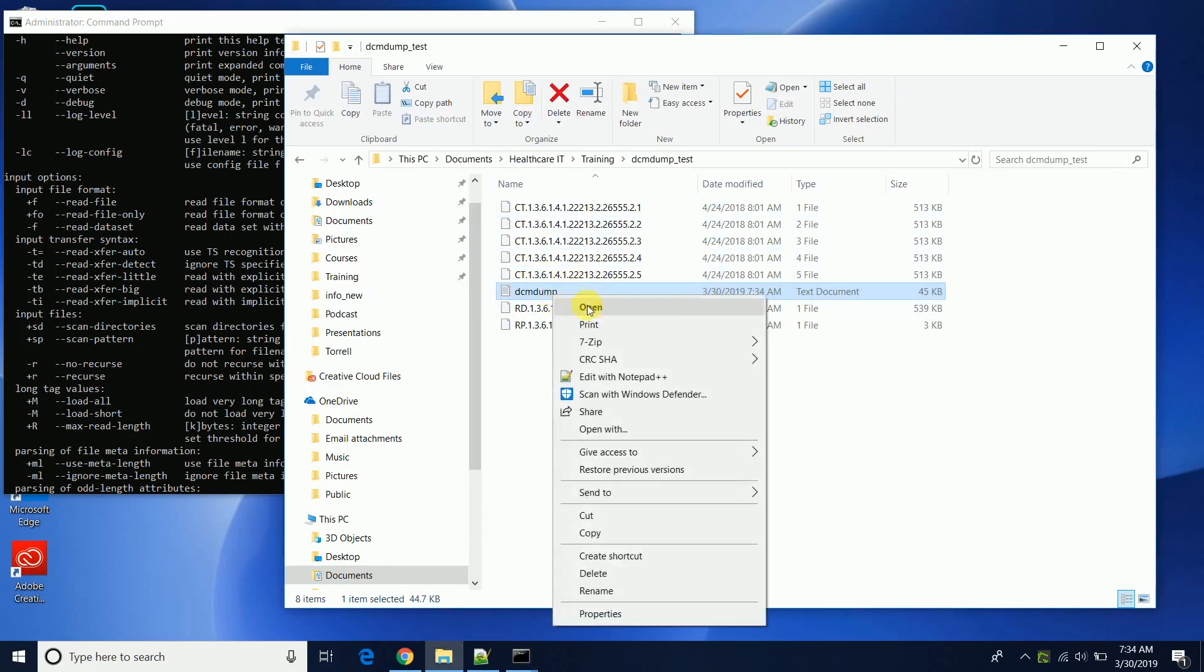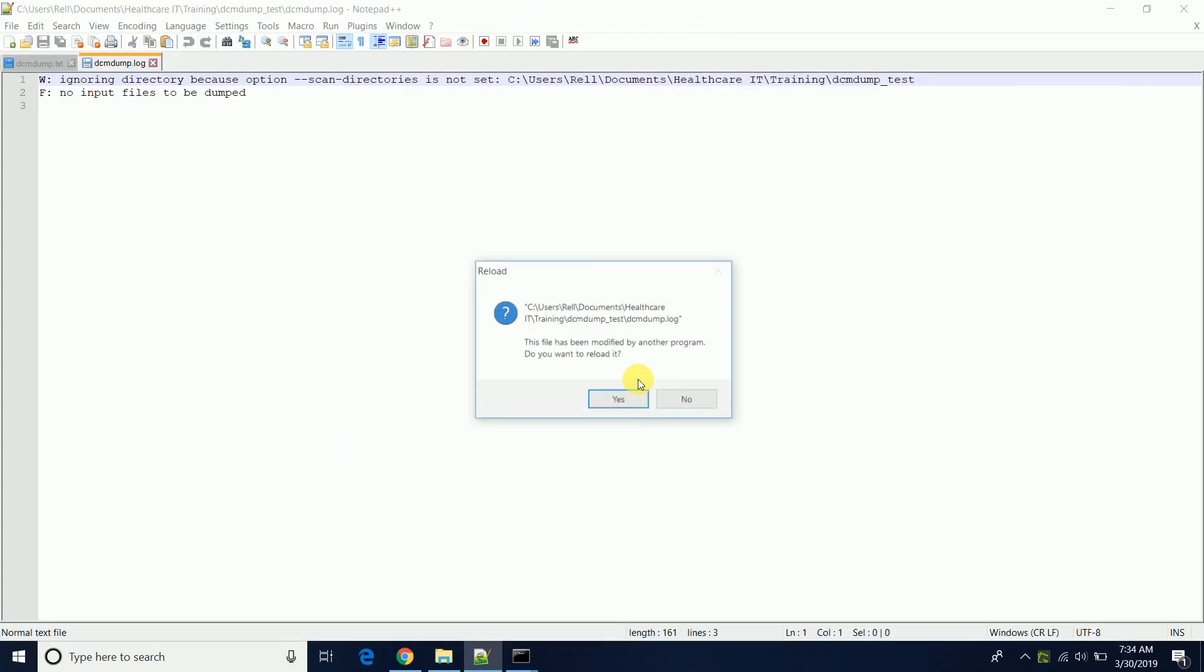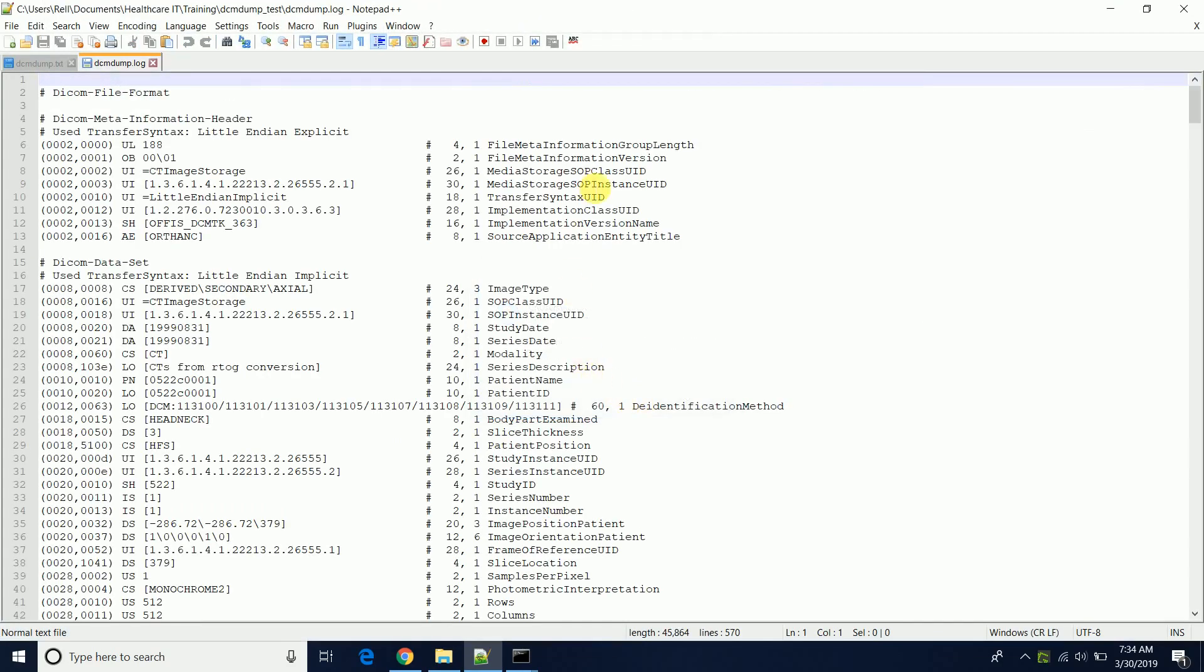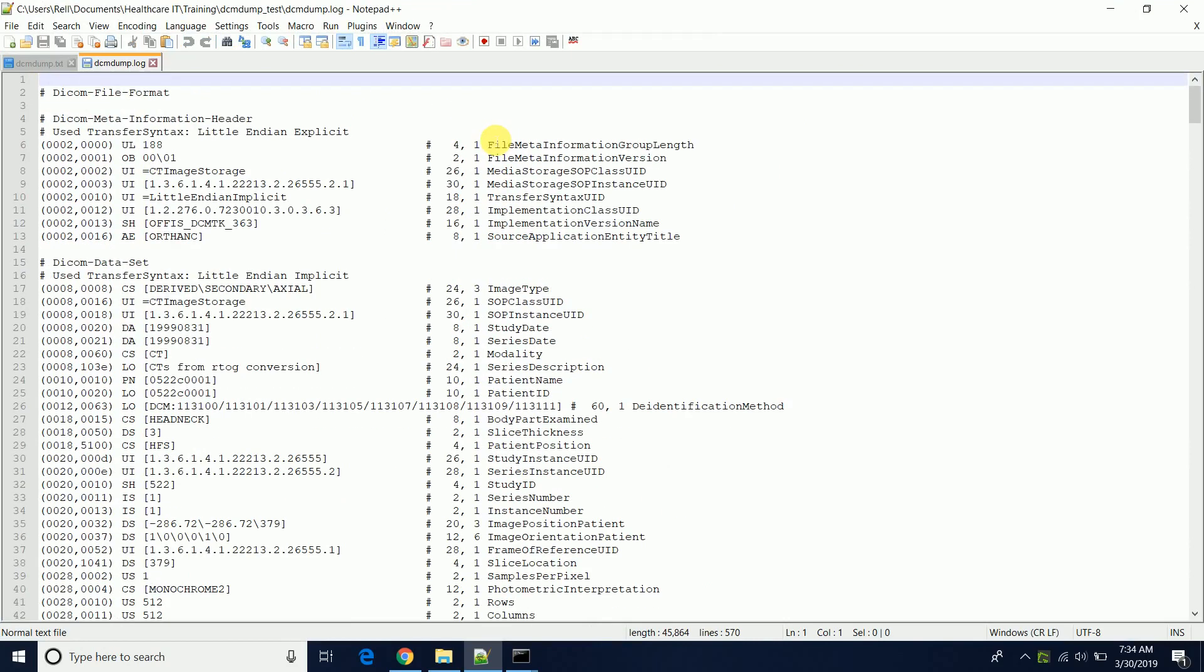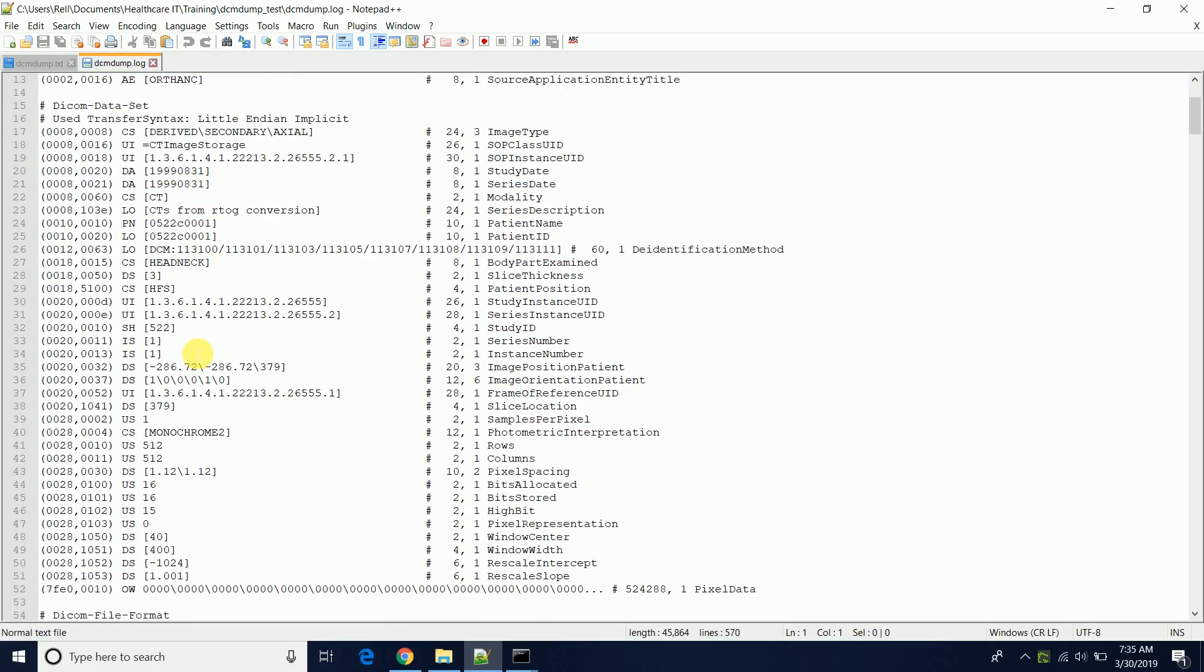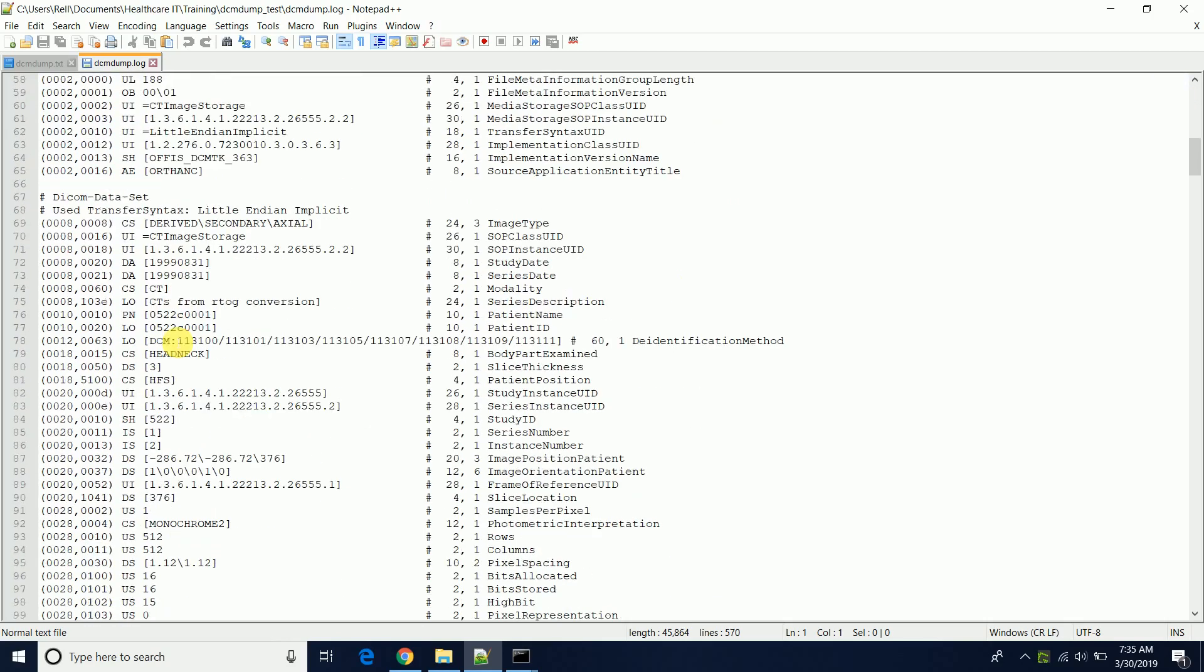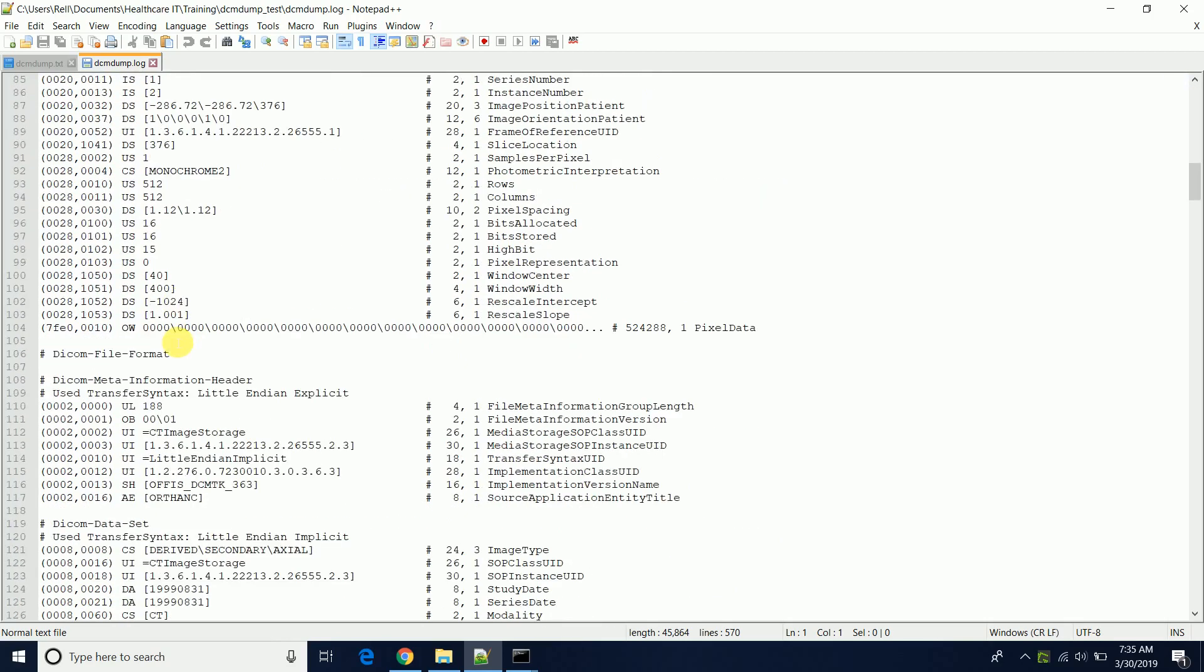So now if we take a look at it, now you'll see that the file is listed. It has displayed all of the DICOM contents for all of the files in that directory, all of the DICOM files.